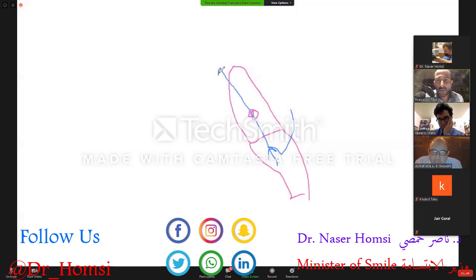And this allowed us not to procline the tooth, to intrude it without flaring even more. Should we retract the tooth? An option could be, for example, using a second cantilever starting from the canine, retracting the incisor. That could be an option, or we could go from the lingual side, because if we intruded from the palatal side, we would have an intrusion with retroclination.